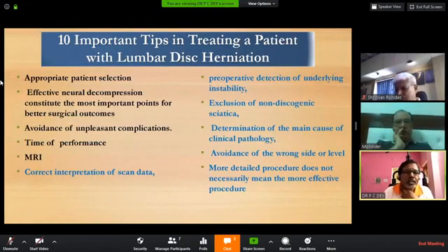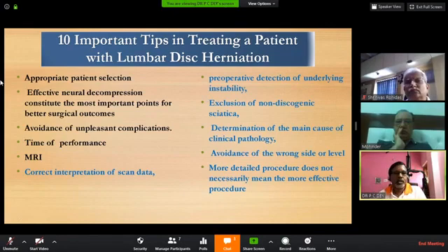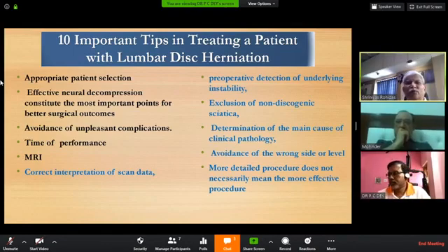Now I want to ask Dr. Rohidas here what to do and what are the precautions that I should take. Precautions are, you have to be very careful. Adequate decompression of the dural sac and the nerve root has to be there. Unless you have decompressed it nicely, don't try to retract it. Otherwise, there will be neural injury or dural tear. So you have to be very careful. You have to do as maximum decompression as possible with the endoscope first, and then retract it.